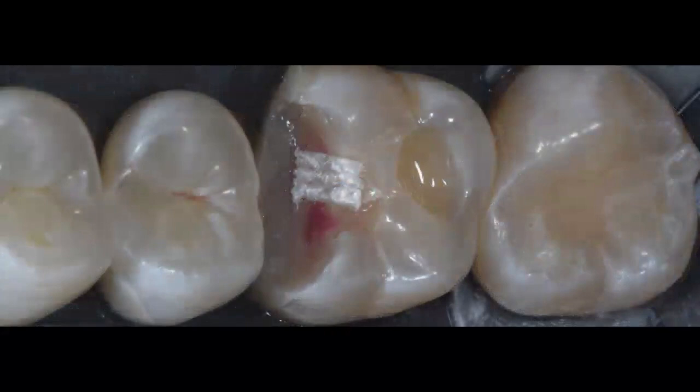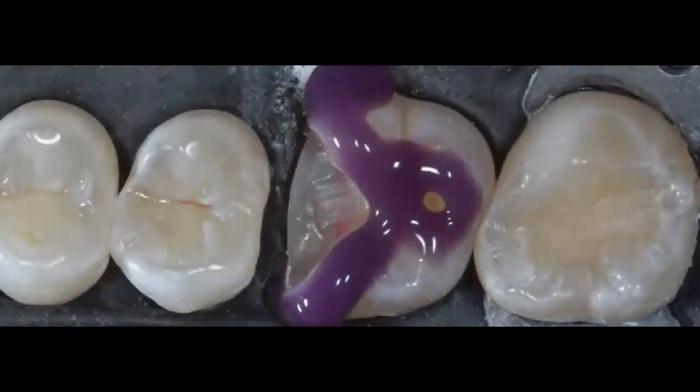So now, in order for me to strengthen that core, strengthen this composite, and also accomplish a better seal in that gingival, in that connection between that deep margin elevation and that proximal wall that I'm going to start building up soon, I'm going to use a ribbon fiber. This is a 2 millimeter wide by 3 millimeter long ribbon fiber that I'm placing within that axial wall, also contacting the new gingival floor that was recreated with my deep margin elevation. And you can see now I've incorporated that fiber within this restoration.